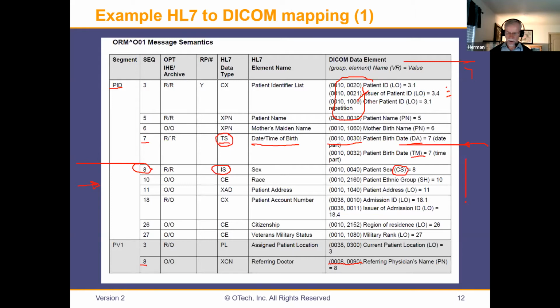So I have this list of information at my modality: patient demographic information, ID, birthday, sex, and so on, scheduling information like 9 o'clock, and information about the procedure. Then this list is copied locally in the modality, most of the time for example in the terminal database. And then that information, in addition to other information from the modality, for example the operator, and if it's a CT scanner, the kV, the mAs, the procedure description, the table height, the slice thickness and so on, all of that, together with the information from the HL7 order that was mapped into the modality worklist provider response, all of it together becomes the DICOM header that is stuck in front of the pixel data, and that is then the DICOM object.